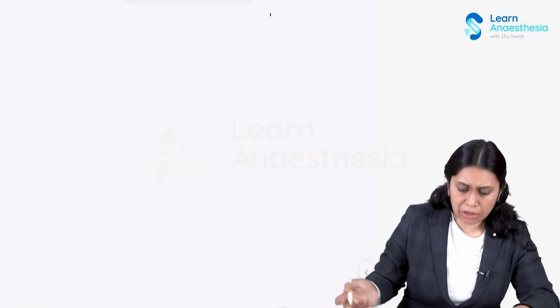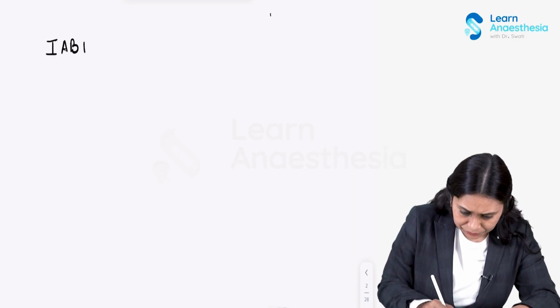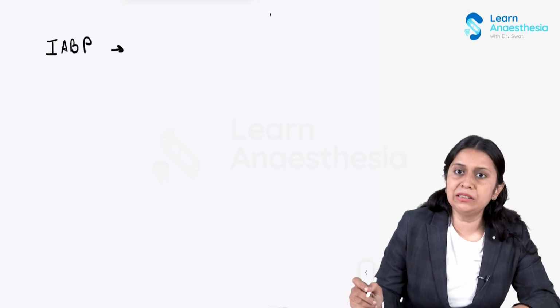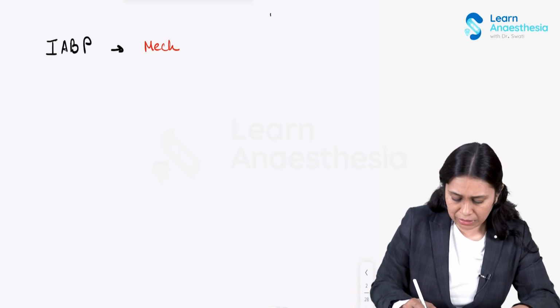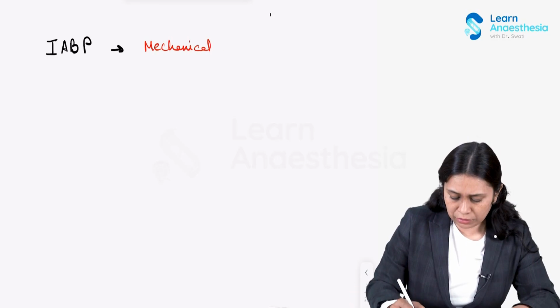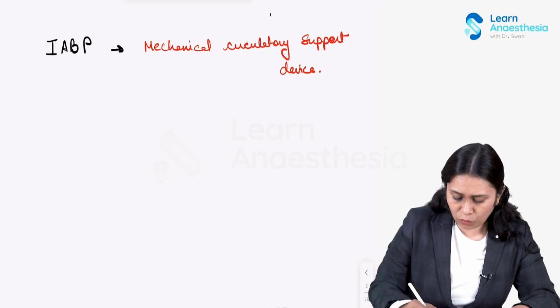So intra-aortic balloon pump, which I will write now as IABP, is a mechanical circulatory support device. And what does it do?